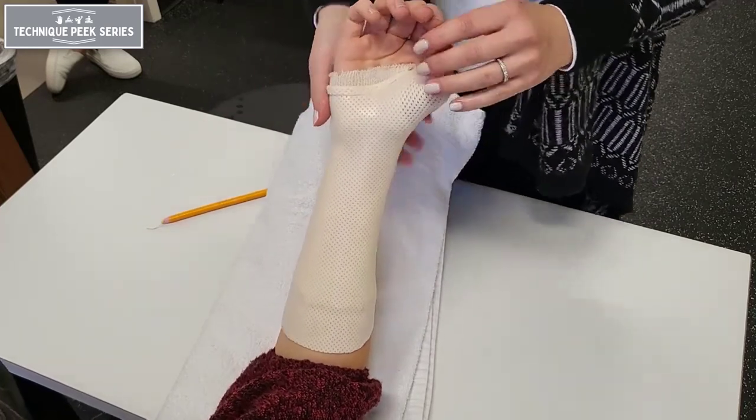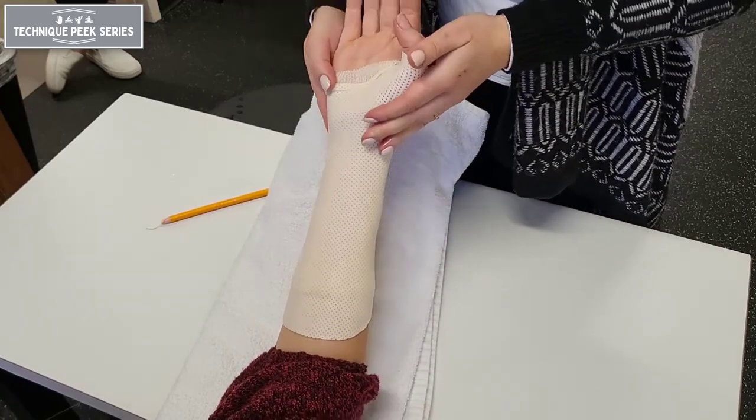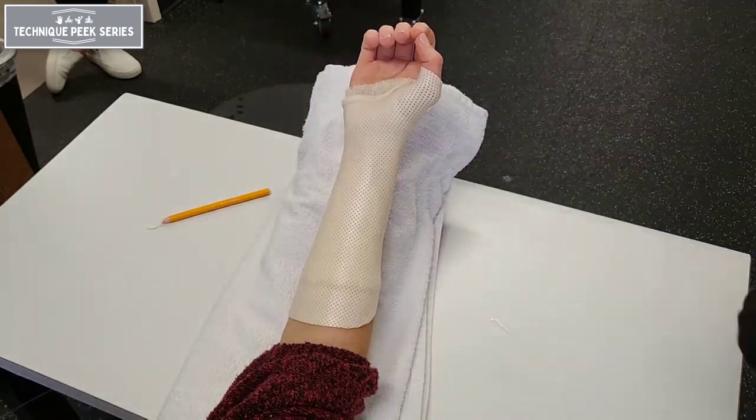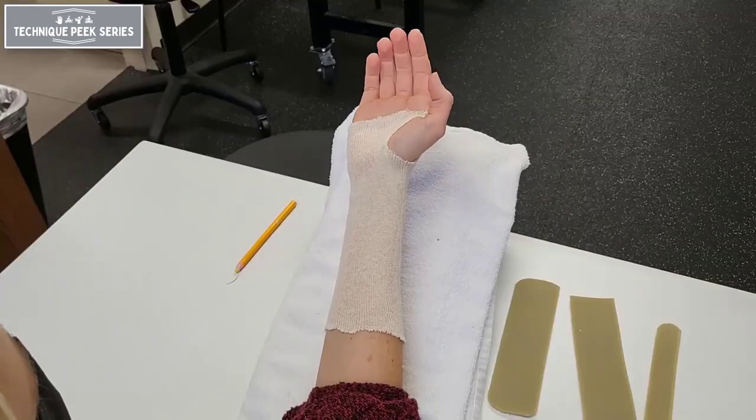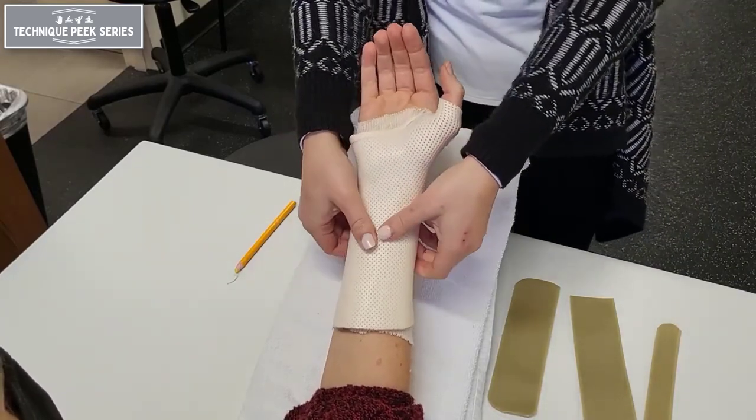Once hardened, check one more time for clearance of the IP joint of the thumb. Also make sure the patient is in a comfortable and functional position of thumb abduction, ensuring they can touch at least the index finger — this will ensure greater ease with functional activity while wearing the splint.